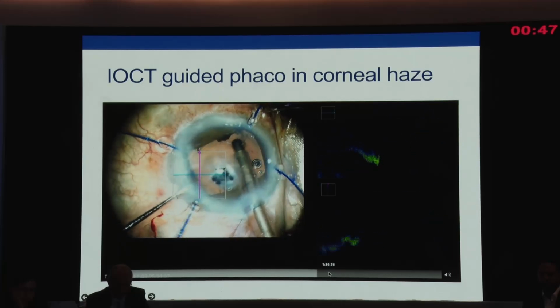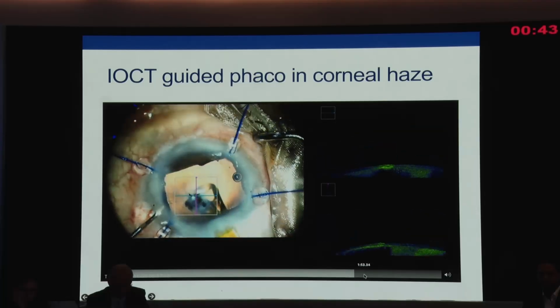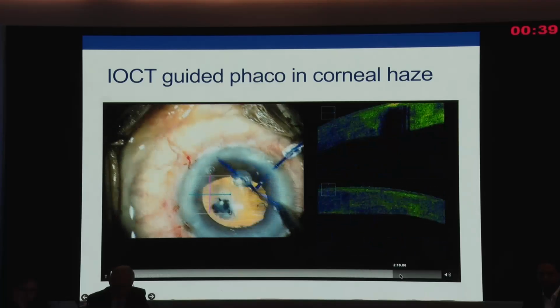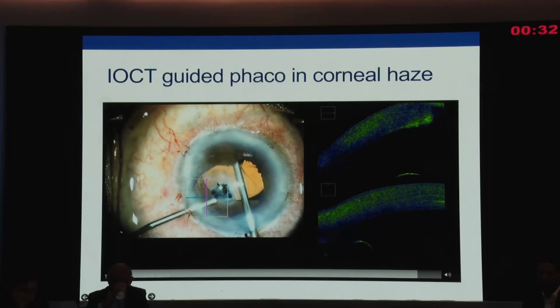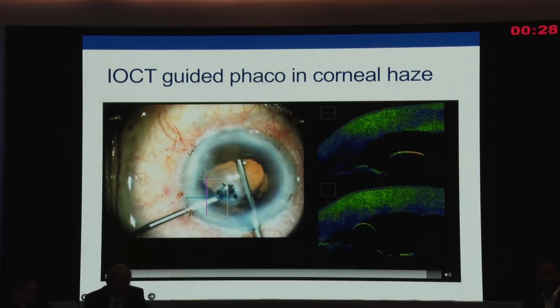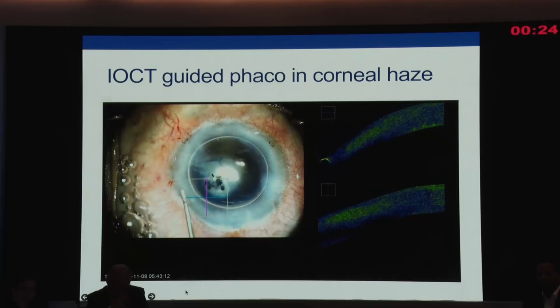And then notice that this is so much better as compared to what we started with. And once you put the IOL, then it becomes again a lot better. And then I do what is called the pilocarpine test. So what I would do is I would put pilocarpine to see where it is constricting, and if I need to, then I would even do a sphincterotomy or expand the area of visualization if required.